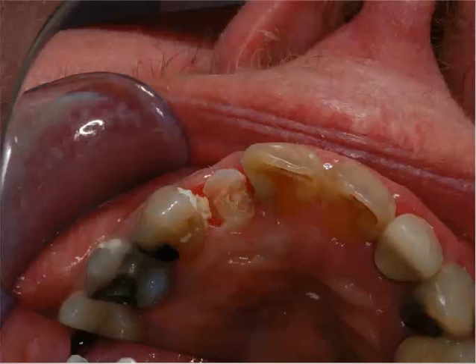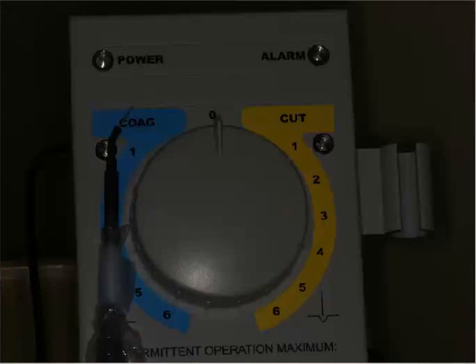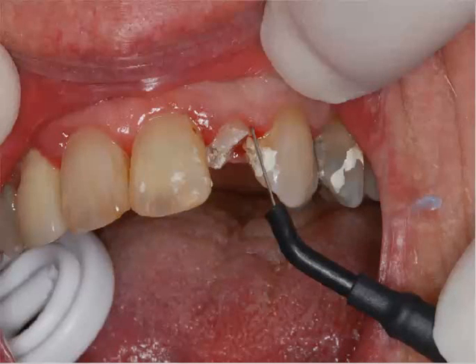because it is, and this is what we're using. You can see this is tip, and this is only sterilized. It's not a disposable tip. You can put it on cut or coag. But you can see this tip right here. It cuts laterally, so not only cuts on the end, but it cuts laterally. So if you really want to open up the sulcus in a quick manner, that will do it.